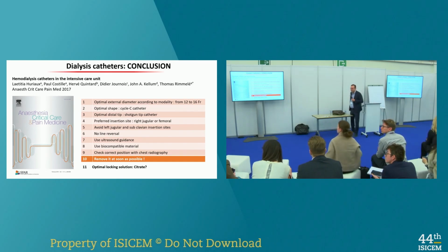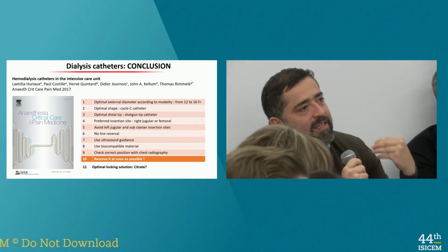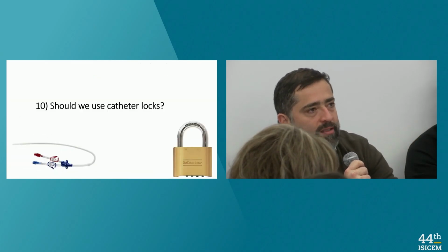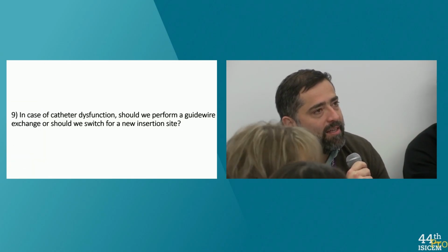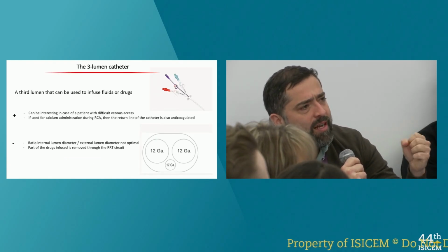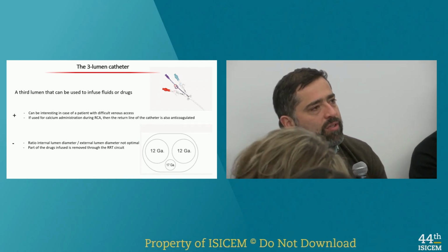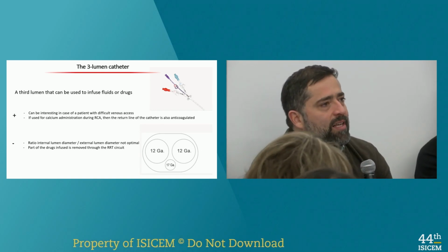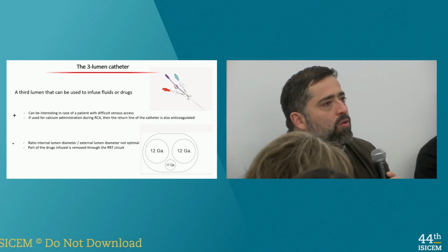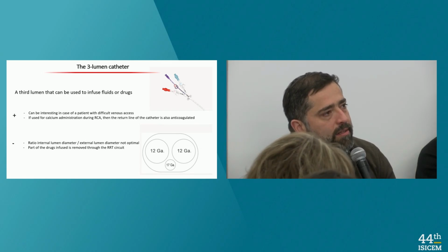Thank you, Dr. Thomas. Two questions, actually. One about accessory ports. A third port for infusion, for medication. Does it worsen the performance of the catheter, and is there any drug that you should not infuse on the third line? And the other would be, if you have a one-directional valve, they use it on chronic hemodialysis to avoid locking. Is there any data on acute setting, because we use them in Brazil. We have used it with no data, and our experience on critical care patients is no good. You lose catheters, I think, prothrombotic, and it's different from the chronic failure.